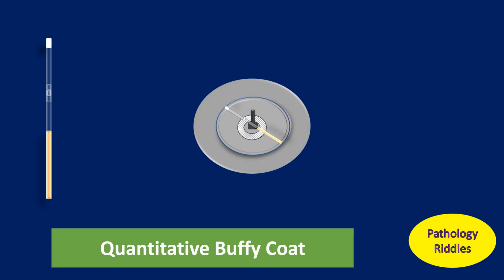Another method to identify parasites is to use the quantitative buffy coat or QBC test. In this, the blood is drawn in a capillary tube which is stained with acridine orange. The tube is then centrifuged at 12,000 rpm for 5 minutes in order to separate the components of blood into layers based on their density. The parasites are then examined at the RBC and WBC interface using an ultraviolet light source.